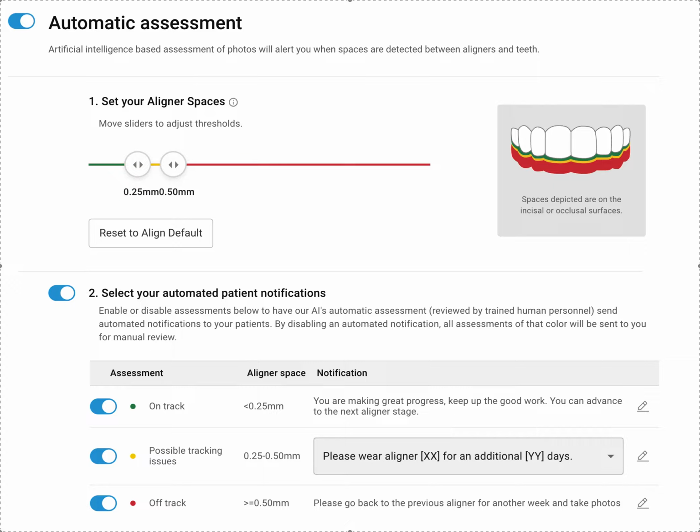So what I recommend, for those of you working with a maybe sub 50 population or a more progressive population, which is definitely not our population, is to give 2 price points. You have your regular price point, and you tell them that with this Invisalign, they're going to be checking in virtually. Maybe initially after the first couple of aligners, we're going to put them on the Invisalign Virtual. You don't have to do it at the start unless they're ready, because it does involve them downloading an app, you downloading an app, syncing the app, setting up some preferences. Not a big deal. If you see their iPhone or Android out and they're using apps in the chair, this is not going to be an issue, okay?